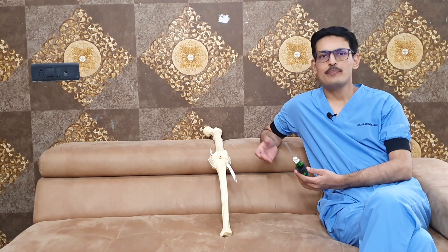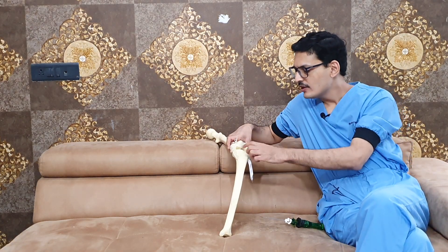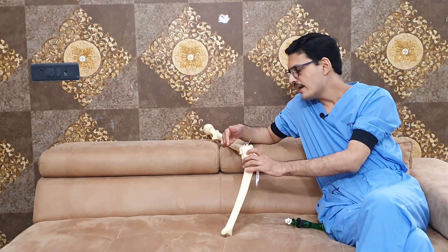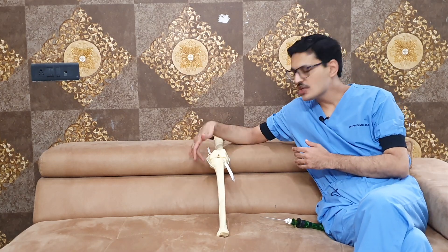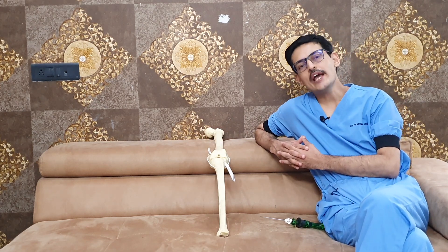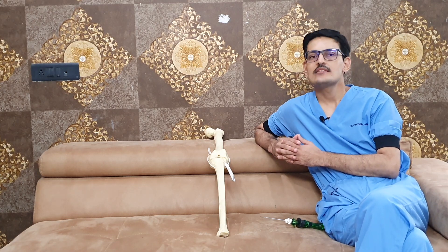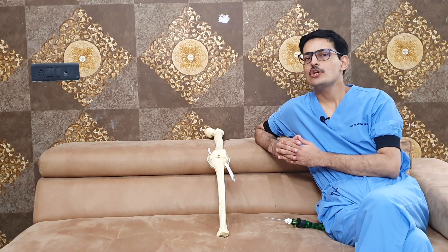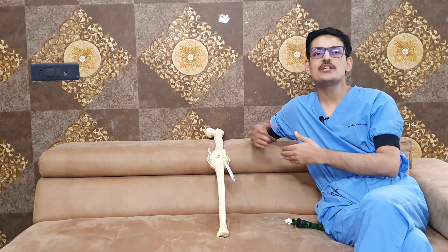The gold standard of meniscus repair is the inside-out technique, in which sutures are passed from inside to outside and tied outside the joint. The disadvantage of this technique is you need to make an incision on the posterior aspect of the knee and tie those knots on the back, which can irritate the knee and cause issues. It also becomes an invasive procedure requiring large incisions on the posterior part of the knee.